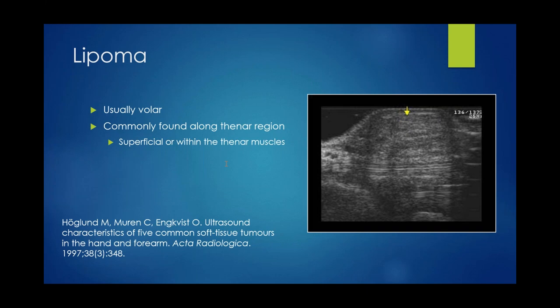The cortical irregularities seen with the PVNS denote the length of time it's been present. And so typically with an inflammatory tenosynovitis, the patient probably isn't going to wait long enough to allow the bone to be involved from the tenosynovial involvement.